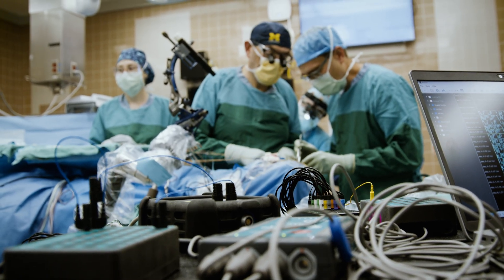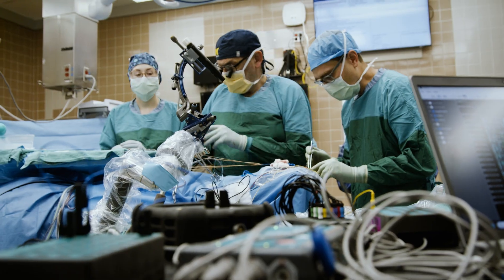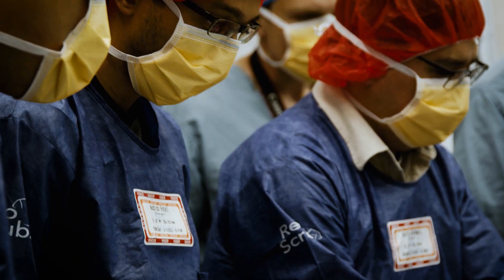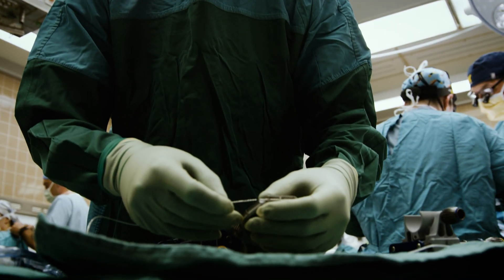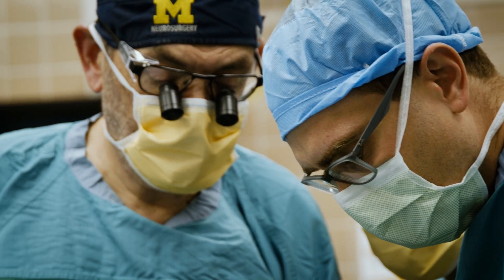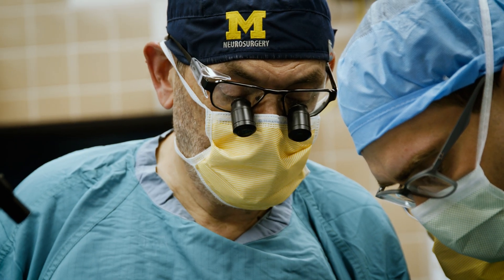With this technology, we're able to record information from the brain in a way that we haven't been able to record it before. We're hoping to learn how this region of the brain is affected in people with epilepsy, and that may allow us to better tailor our surgeries and other therapies for these people to better treat their disease.